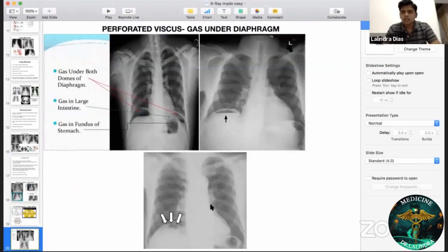Right. So that finishes your chest X-ray pathological conditions. Chest X-ray abnormalities I have completely covered. Actually, most of the medical conditions I have gone through. Now we are going to go through a few more abnormalities that you see in a chest X-ray. Actually, these are surgical conditions.